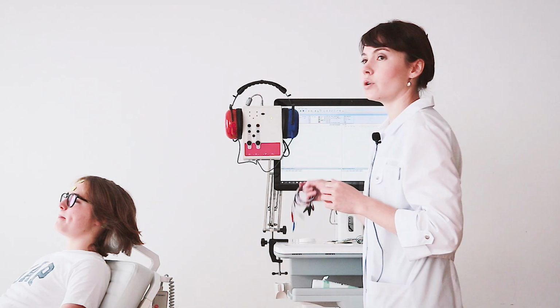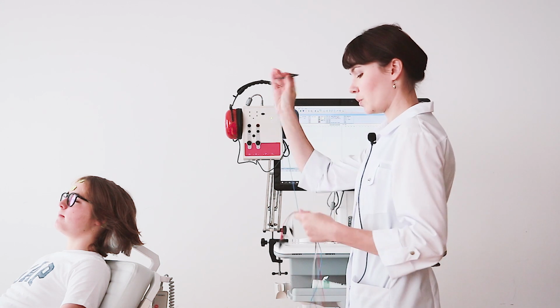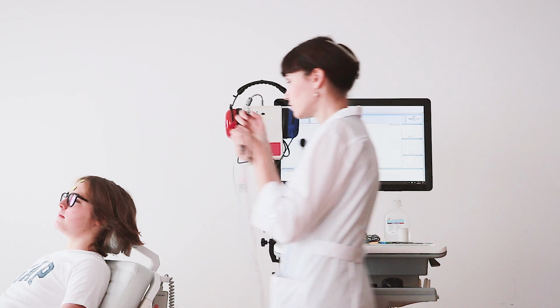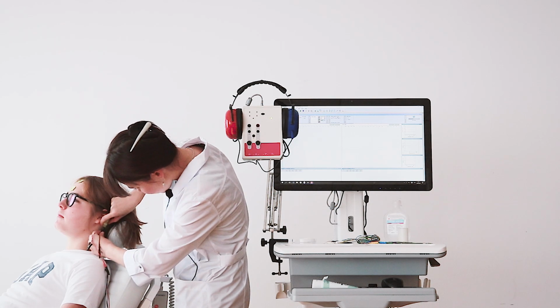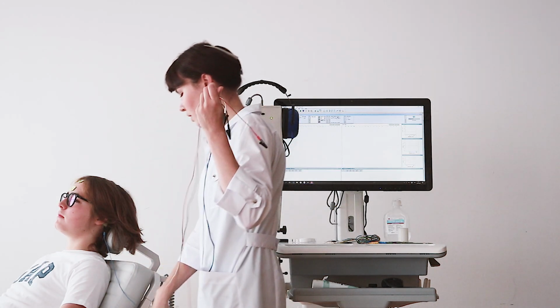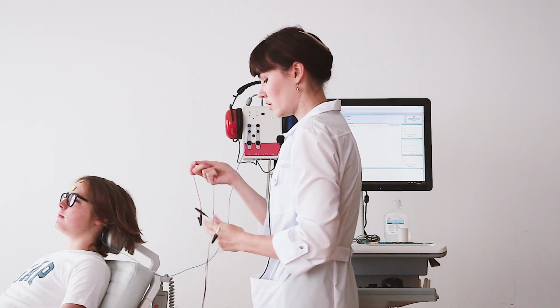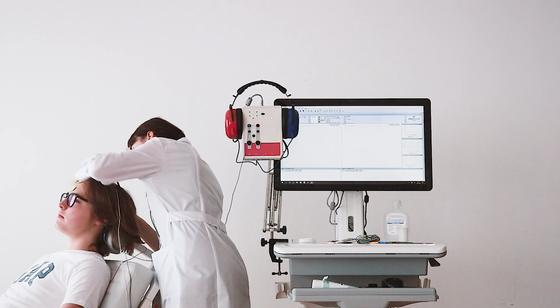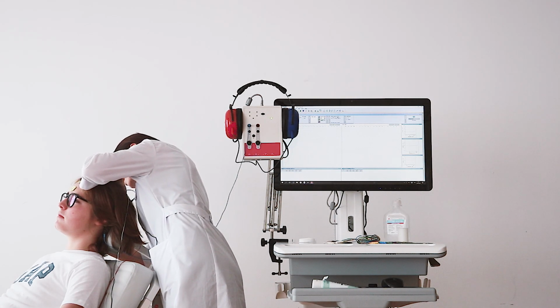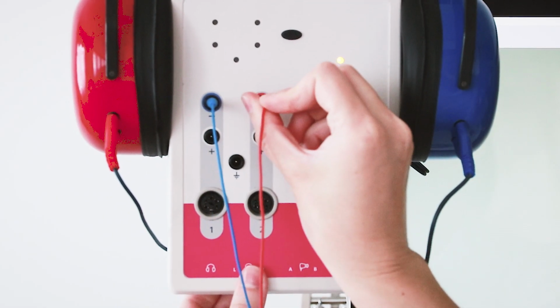Now we need to connect our electrodes to our amplifier via special connecting cables with alligator connectors. Firstly, we connect the active electrodes. The first active electrode is situated behind the left mastoid. We connect it to the first minus channel of our amplifier. The second active electrode is situated behind the right mastoid. We connect it to the second minus channel of our amplifier.